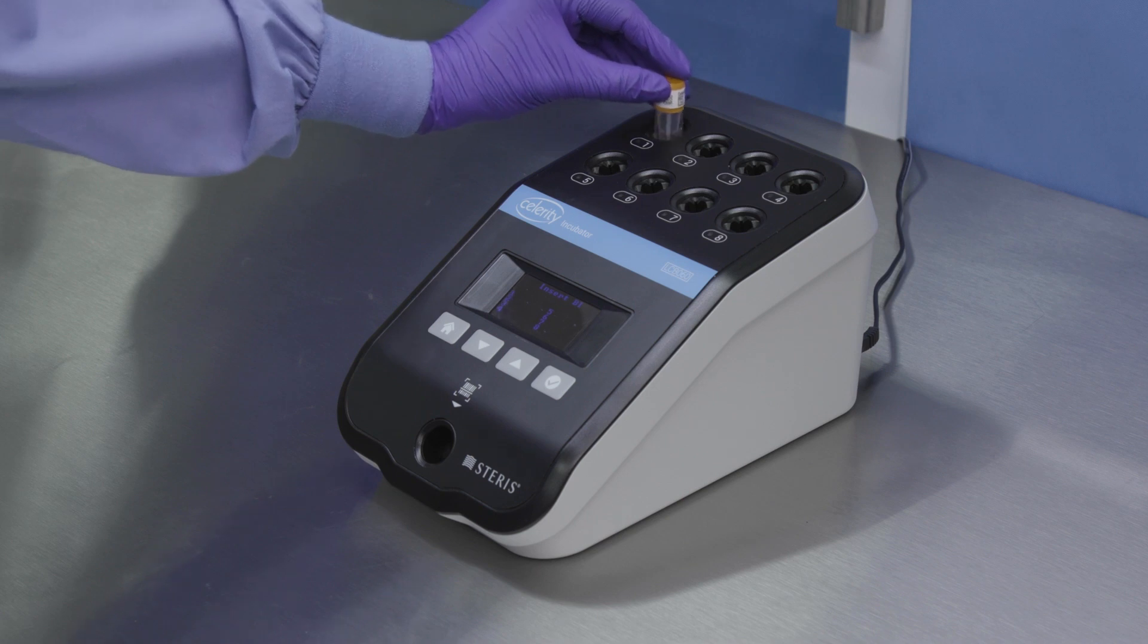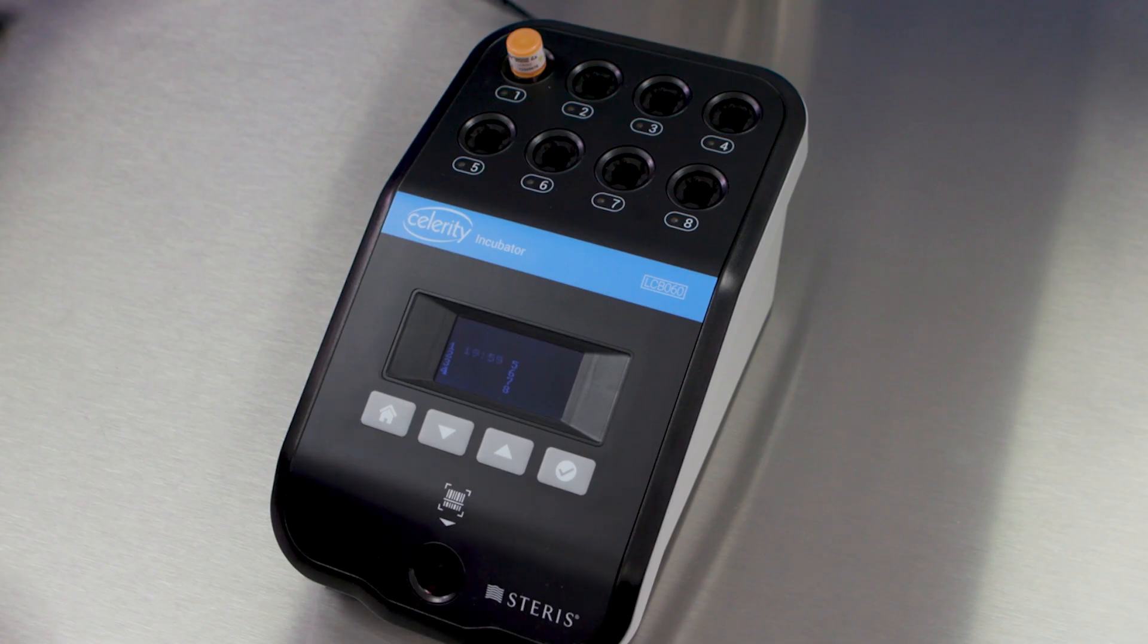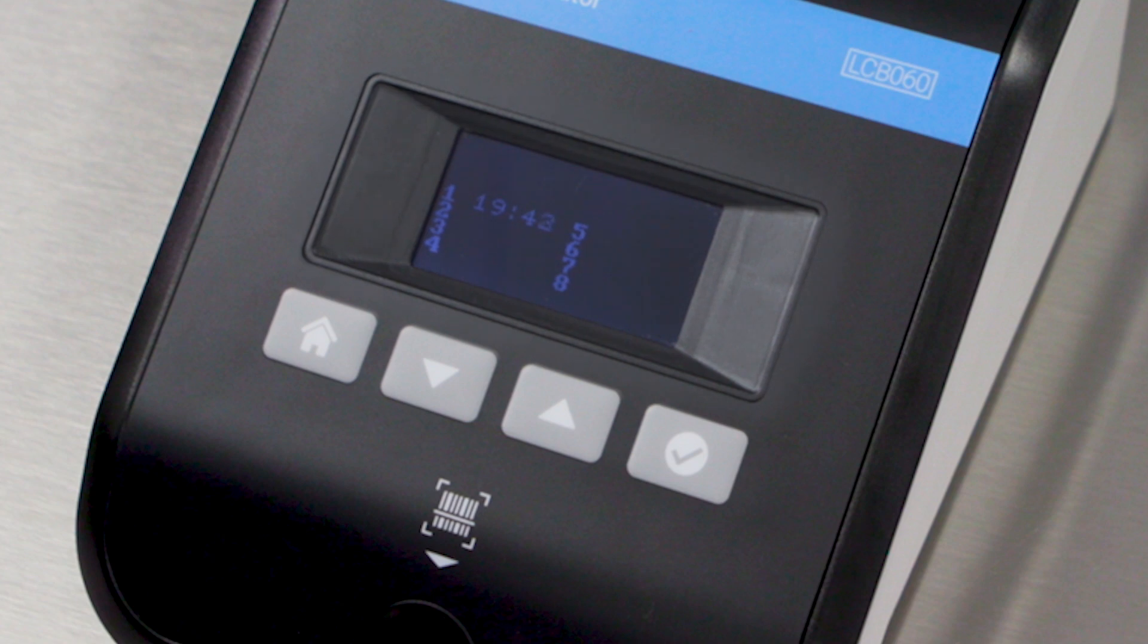Place the activated BI in any available well. The incubator will automatically detect and begin reading the BI. The corresponding slow flashing green light indicates the well is in use, and the remaining incubation time is displayed on the screen next to the corresponding well number.